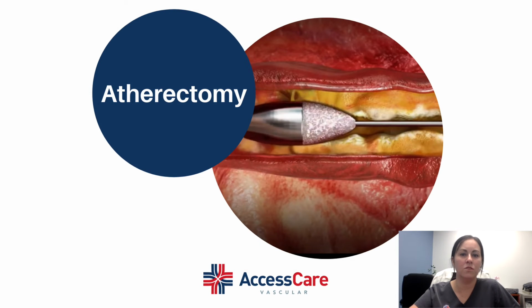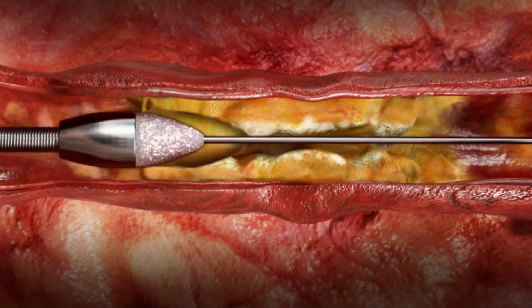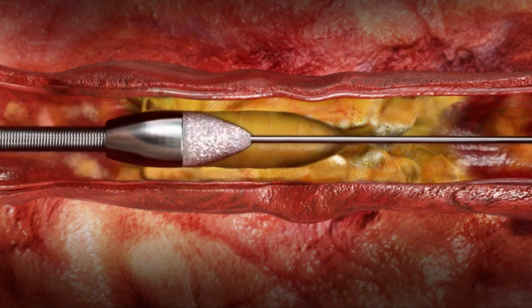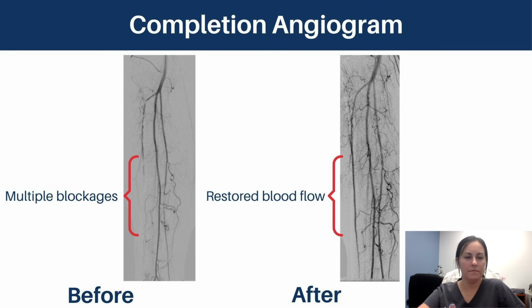Atherectomy is sometimes used to mechanically remove plaque from the artery. A small rotating burr is guided to the area of plaque. The vascular surgeon then activates the burr, which rotates and breaks apart the plaque. The plaque is either sucked out of the artery or ground up into microscopic pieces and eliminated by the body. Last, a completion angiogram is performed to assess and improve circulation.